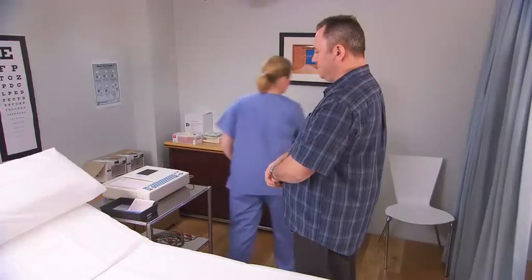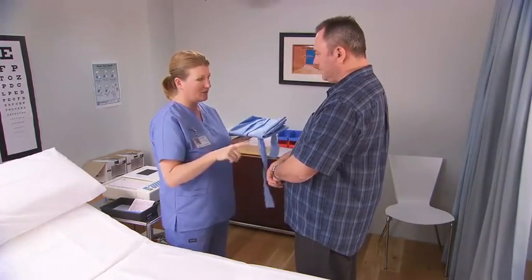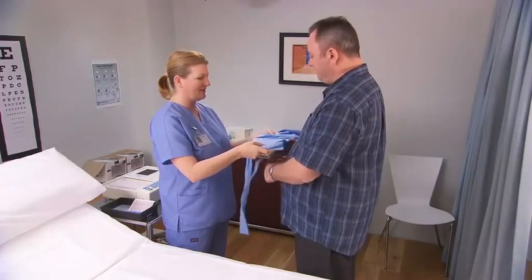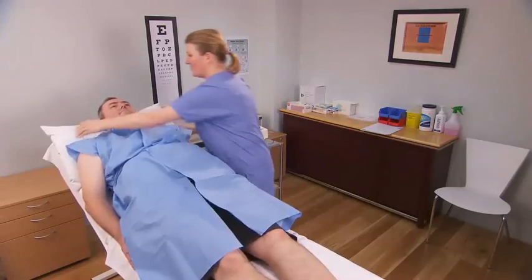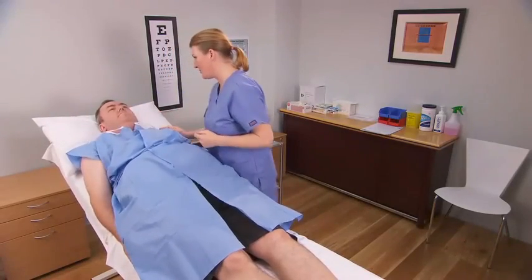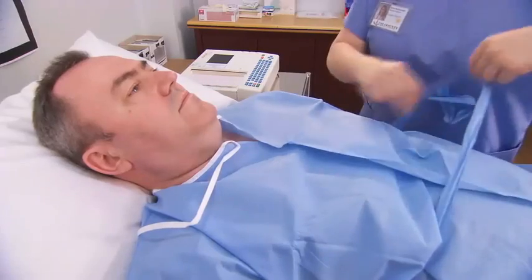Explain the procedure to the patient and obtain verbal consent to proceed. Ask the patient to change into a gown, remove any socks or jewelry, and to turn off any electronic devices including mobile phones. Position the patient semi-recumbent on the examination table using pillows, and give them at least 10 minutes rest time before you start the procedure.